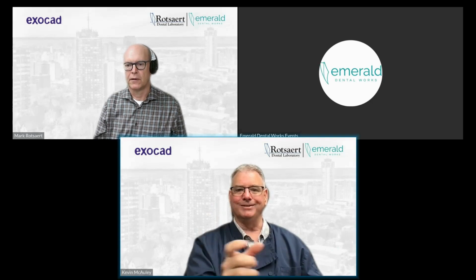But primarily what I see from a planning perspective is one or two teeth. We're seeing more and more full arch. That may just be relative to our market here. It's not that we don't do them. We just don't see the demand that much. So I would say most commonly it's a single tooth pilot or fully guided, or two or three teeth where we're seeing the guides being used.